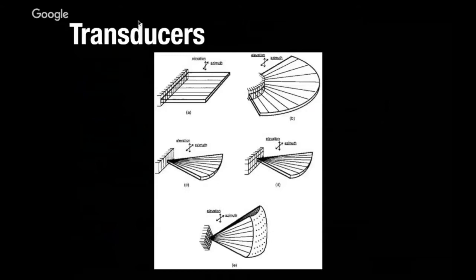And what the probes are really doing is not boom, and I shut off and listen. It's boom over here and I shut off and listen, then boom over here, then boom over here, and I'm processing, like, could that be side lobe coming back from here, which there's a ton of, like, high-tech, multi-face reconstruction going on. We can always think about it in the simple way of one vibrating speaker going into the body.